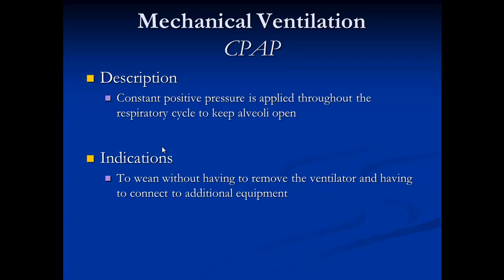CPAP is basically constant positive pressure that is applied throughout the respiratory cycle. This is a weaning mode as well, and this is basically the last weaning mode before extubation.